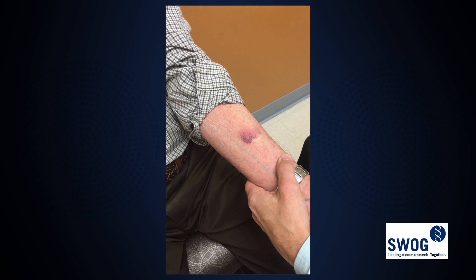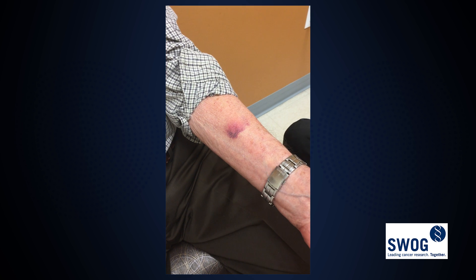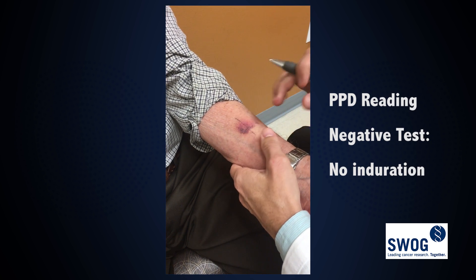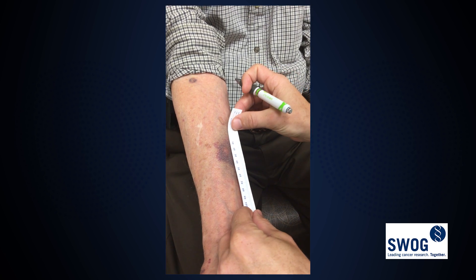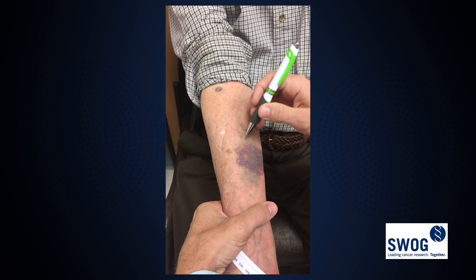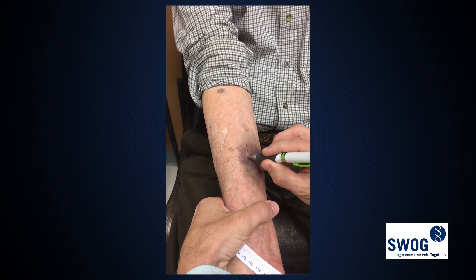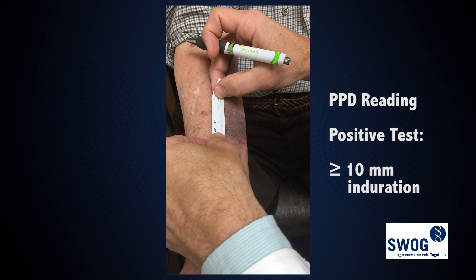There's some redness here — the redness is probably 20 millimeters. But what we're really interested in is whether or not there's any induration. In this case, there's no induration, so it's negative. On this other site, we'll measure at a 45 degree angle — that's about 10 millimeters, so that's positive.